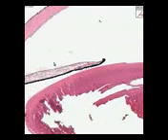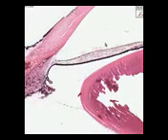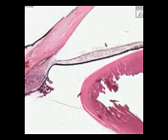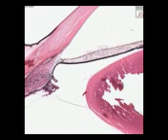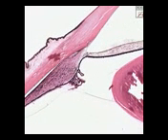What else do we want to say about the eye? What else can we say about the eye? I don't think we can. It's too bad we can't see the retina, but really, you could always look at the retina and talk about the various types of cells in it, in the classical layers, you know, the inner granular, the outer granular, blah, blah, blah. I don't believe in that kind of stuff.